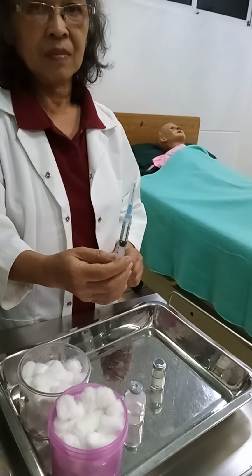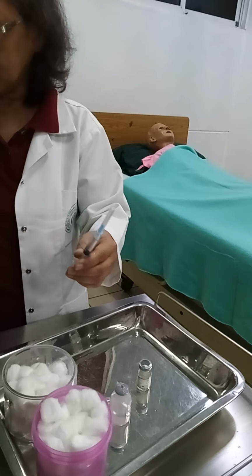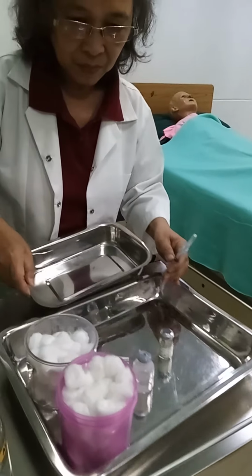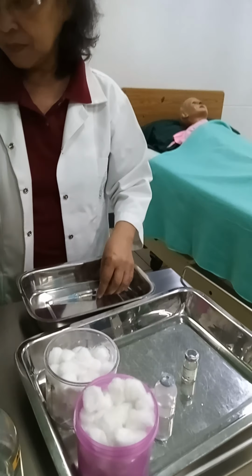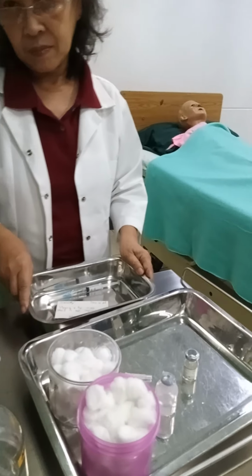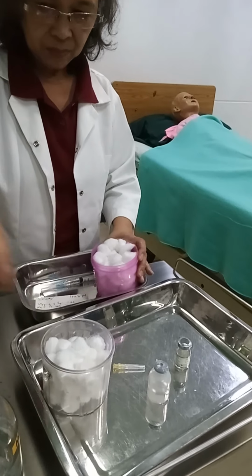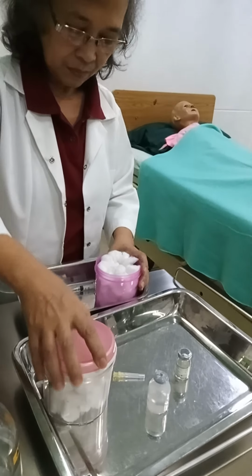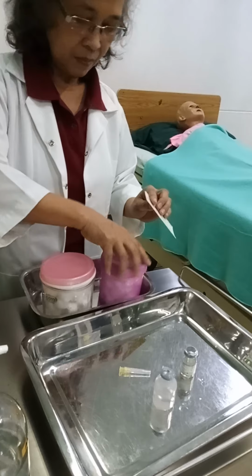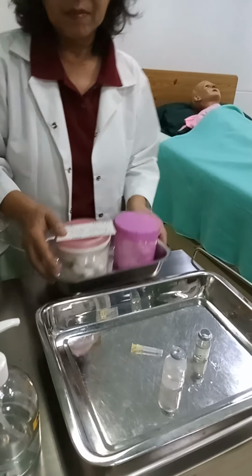So you are now ready to administer the medication with your medication tray, your medication card, your cotton balls with the alcohol and dry cotton balls, and then you can now bring the medication to the bedside.